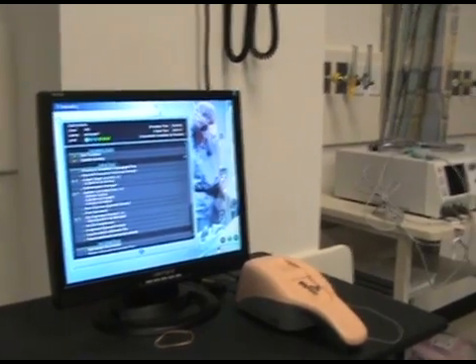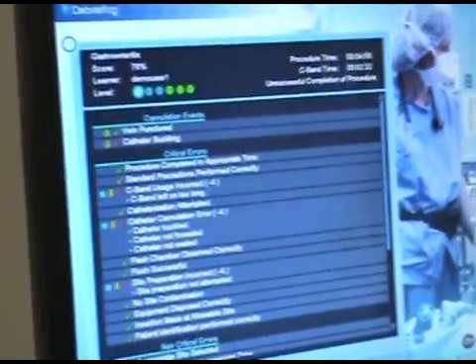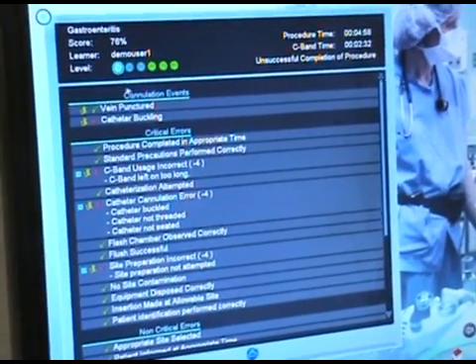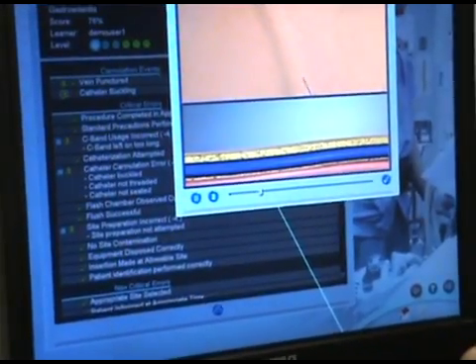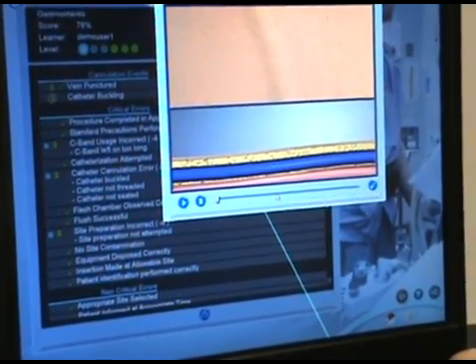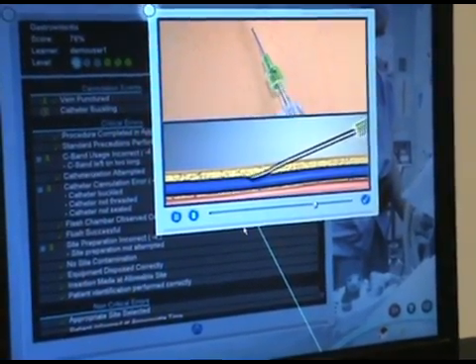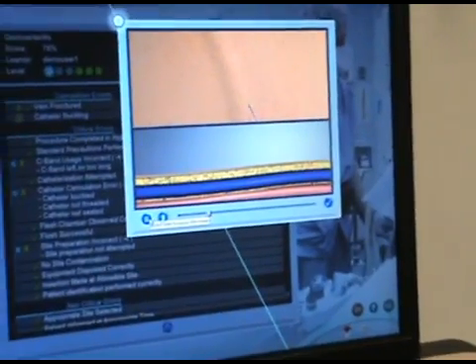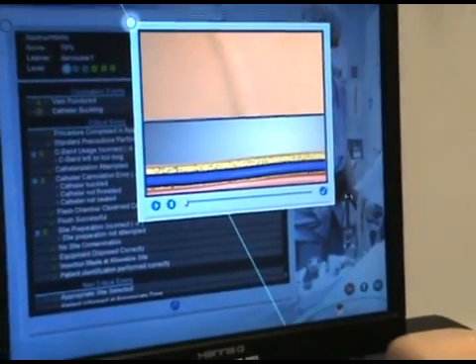Let's see how we did — let's do the debriefing. We're in the debriefing. As you can see, I got a 76%. These are what I did wrong and what I did right. For example, let's click on catheter buckling and see what I did wrong. I inserted it, but I didn't hold the skin tight. See — I got it. So that's what I did wrong. Obviously this machine is very sensitive.